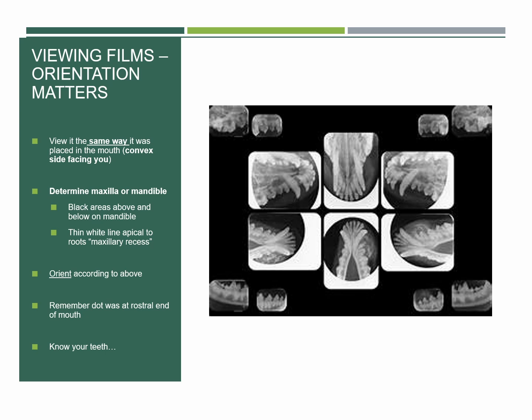Determine maxilla or mandible, so which one's which. You're going to be labeling them, because you can actually label them. It won't show up on your film, but they'll come up digitally labeled.